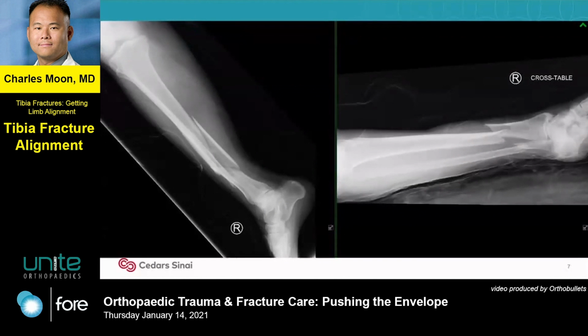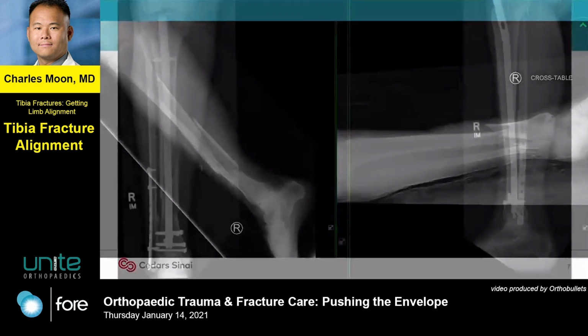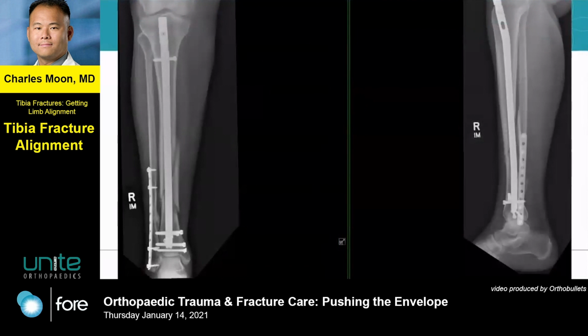So here is a patient who has been defeated by gravity. A relatively regular, typical tib-fib. And you can see what we did is help ourselves out. We spanned the fibula. We didn't do anything too crazy there, just lined it up indirectly and got a couple of screws in there. Probably could have put a little more bend in the fibular plate, but it wasn't really an ankle injury, so we weren't worried about pushing that over too much. That struts everything out for us and allows us to feel very confident about this tibia alignment and place our nail.